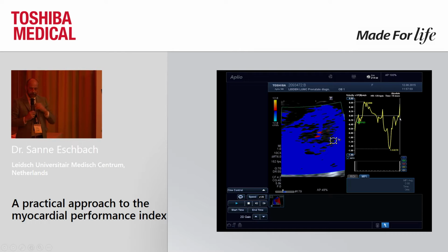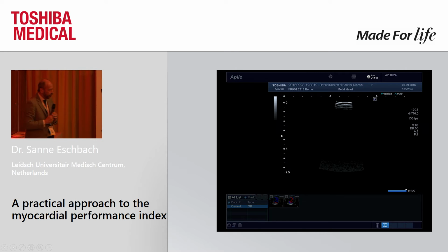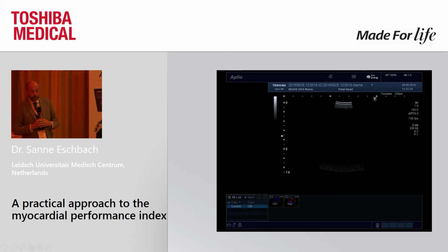I appreciate your concern, but in practice, it is not so critical for this kind of ratio, and that's a good thing. And the fact is that it's highly reproducible and easy to use. So it is really a very good function for the clinical daily routine. And typically, we try to get frame rates over 100 to be very effective. And this is a very good temporal resolution, which seems to work.